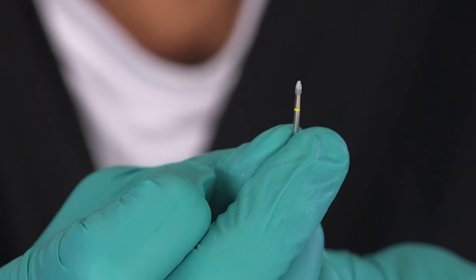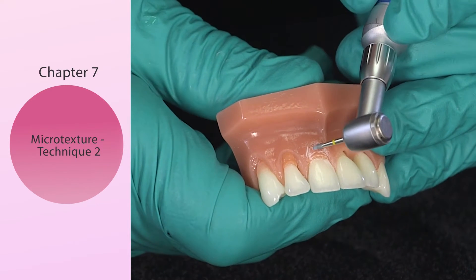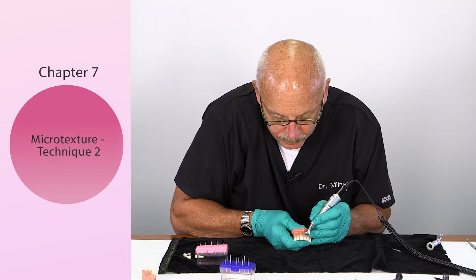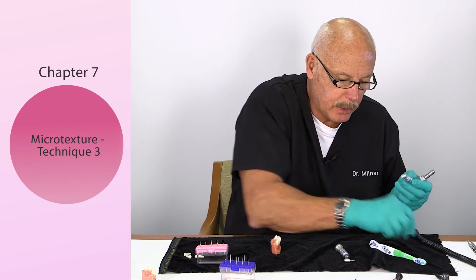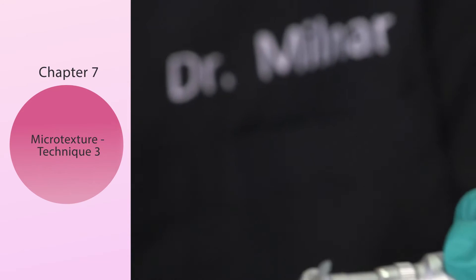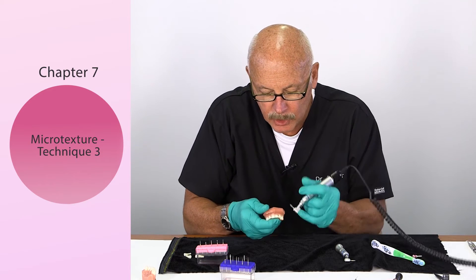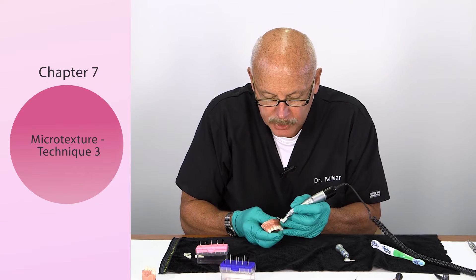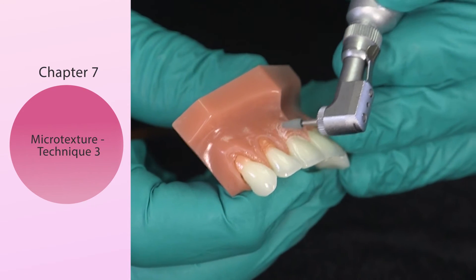Number two: take the egg-shaped yellow striped diamond, put it in and extend the shank out. You can just use the point of the burr and do a variation of stippling. Number three is going to be with a slow speed using a silicon carbide or carborundum stone. With the green stone — which I use in my classes for composites — you take the tip and don't puncture and stab at it. It's a delicate dance with the green stone.